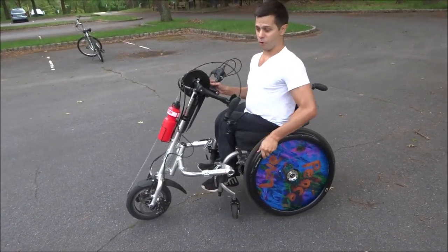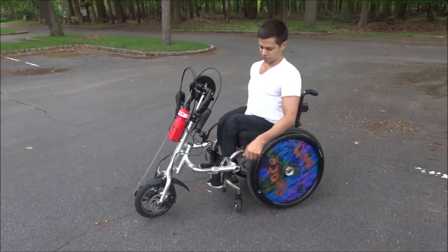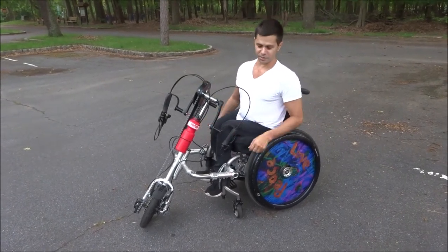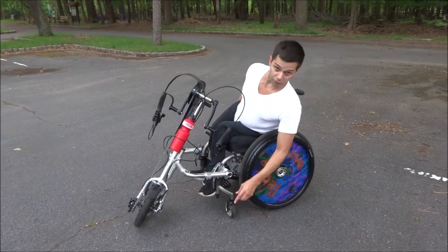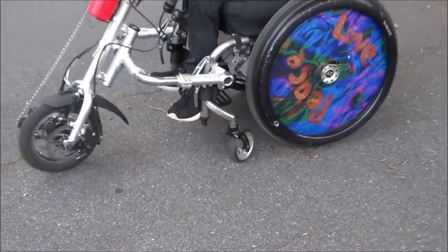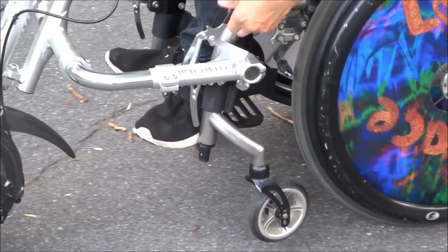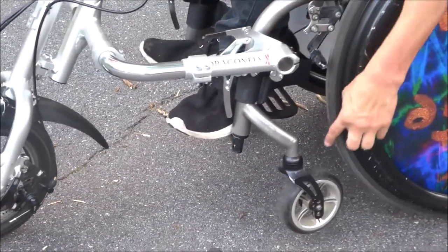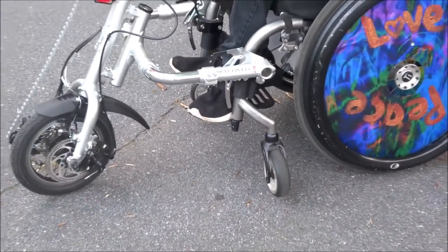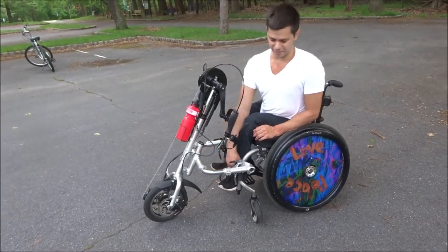Anyway, I'll take it off one more time and then we'll end the video, so here we go. Latch number one, latch number two. If you noticed, the wheelchair — if you could just focus on this front caster here — when you put it on and off, what happens is the front casters of the wheelchair go up in the air. So you're not actually riding on them; you're just riding on the back wheels and then the front wheel of the attachment.